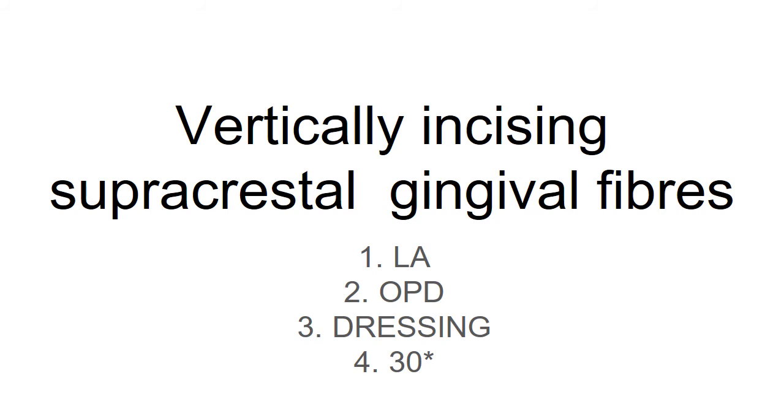The incision is placed such that at least one tooth mesial and one tooth distal to the tooth is also involved. That is, say you want to perform the CSF procedure for the maxillary right canine, then the maxillary right first premolar and the maxillary right lateral incisor should also be incorporated into the procedure.